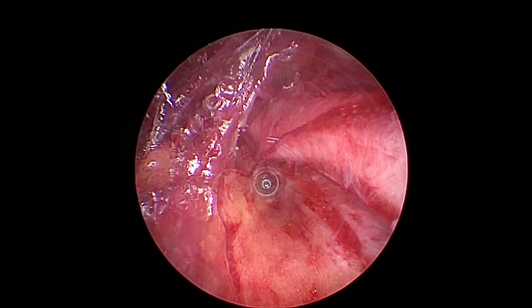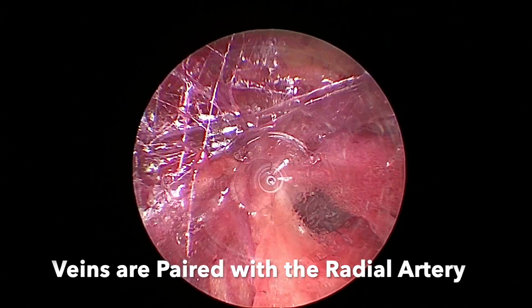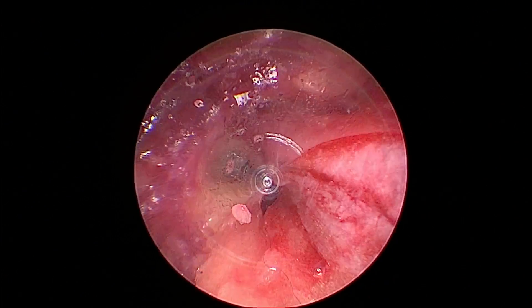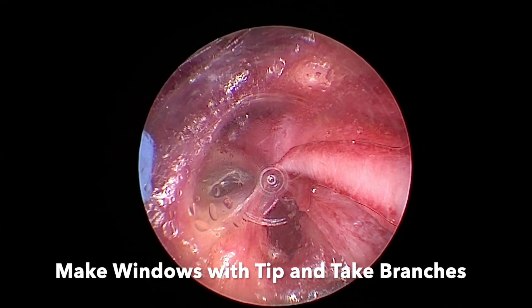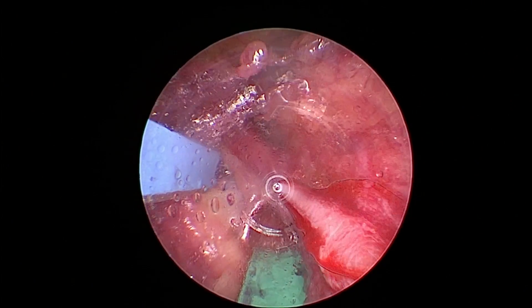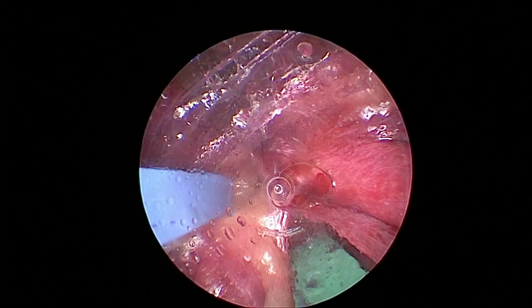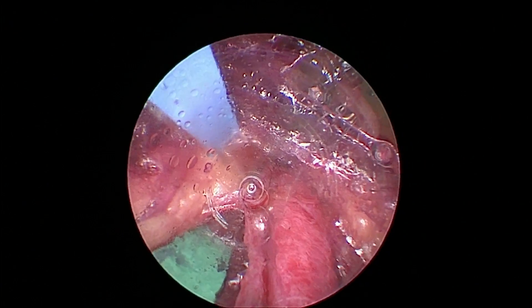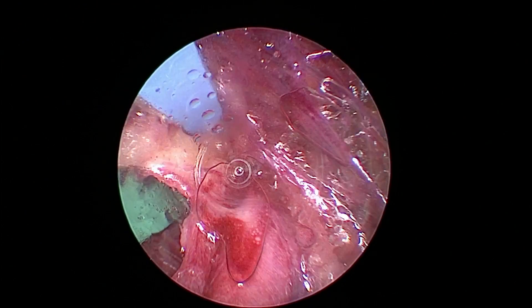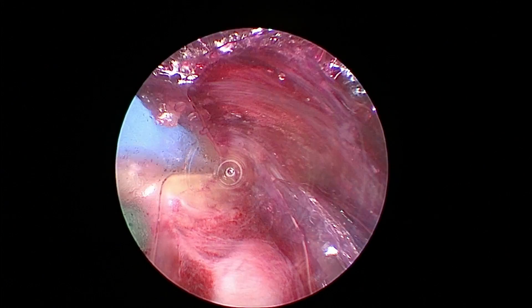Here I'm identifying the vein that's paired with the artery and I'm just doing my dissection lateral to the vein. I make a little window and then go in and cauterize and cut the branch. There's not a lot of room in this tunnel when you first start your radial artery harvest, so it's important to take your time — just make little windows, create space, and go in with the bipolar and cauterize and cut the branches and the fascia as you move up the tunnel.